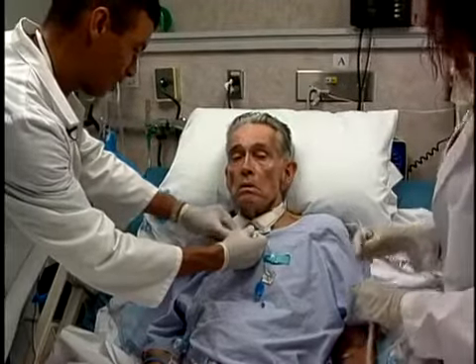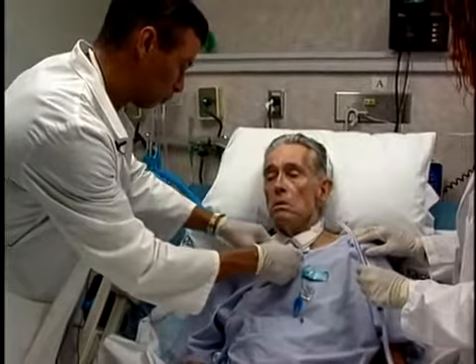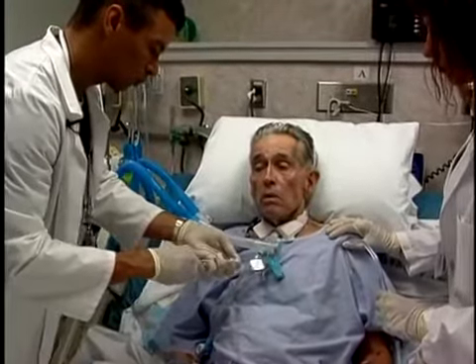When treatment has ended, the valve is removed and the original circuit setup is replaced. Return the ventilator settings and cuff to their original pre-valve status. Observe the patient for several minutes to ensure stability.